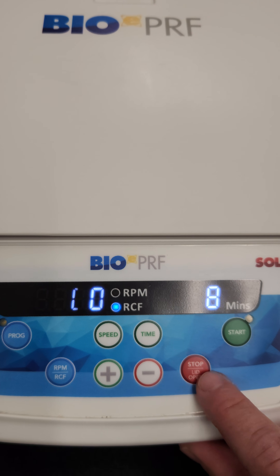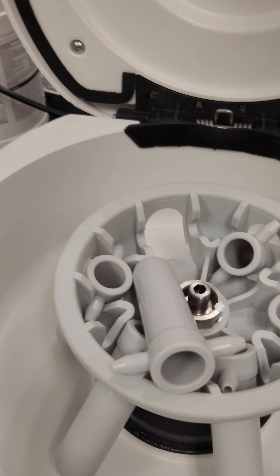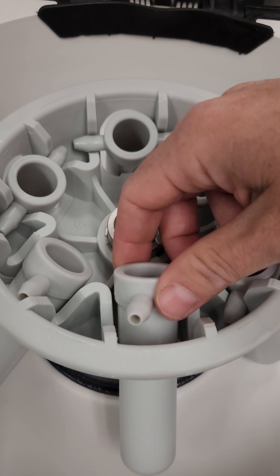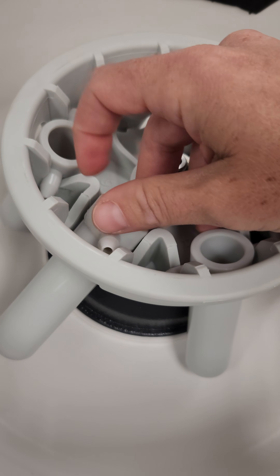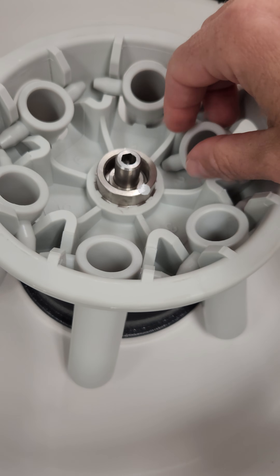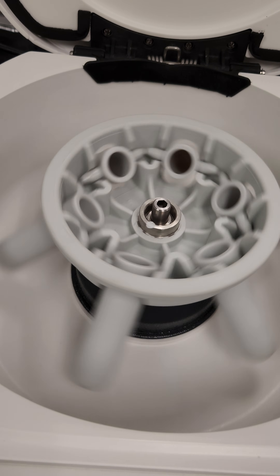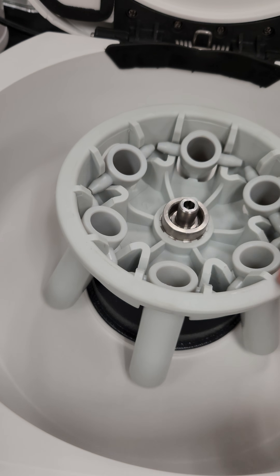To open the lid you're going to press and hold this button right here. That pops right open and then you want to make sure that the buckets are sitting correctly all throughout. You'll see some of these are twisted — they should be sitting like this so that they can move. Make sure all of them are in the right position and give it a quick spin to make sure all of those tubes are able to fully extend outwards when spinning.